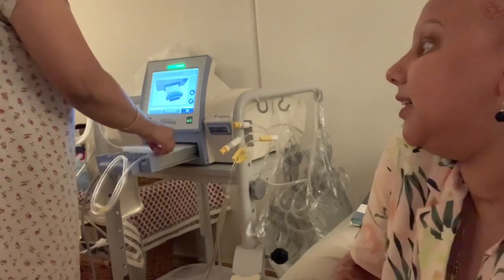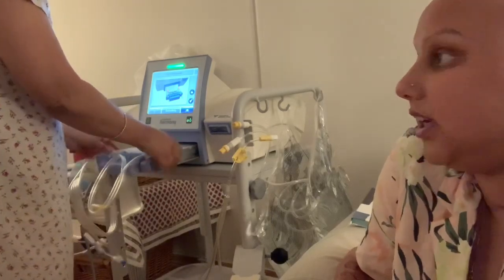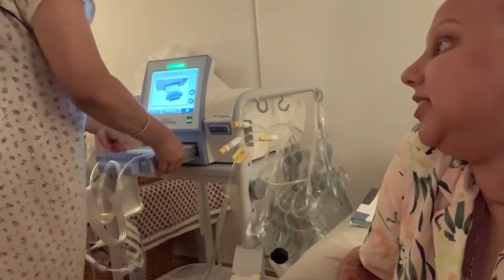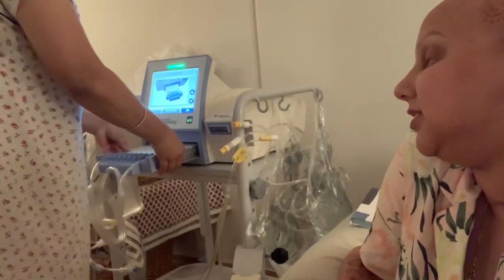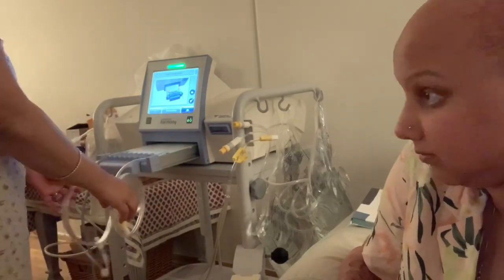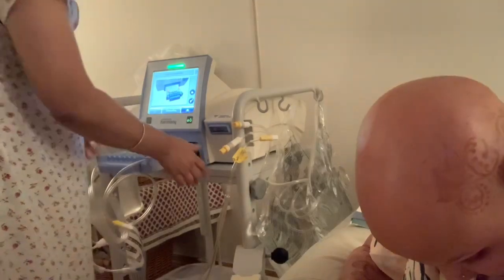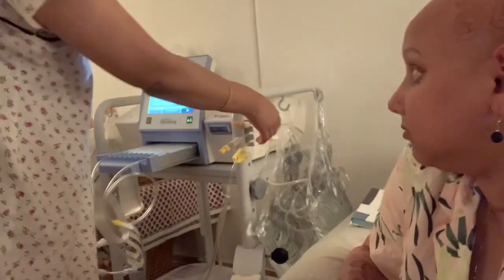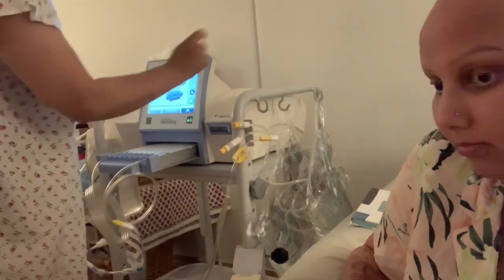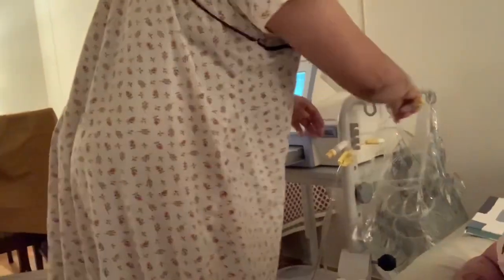You just place it in there in the corner — it's kind of like a disc that the machine reads. So it's in now; the wires are not on the floor, they shouldn't touch anything. Now I take the plus sign and the wheel, then I start taking these out one after the other.